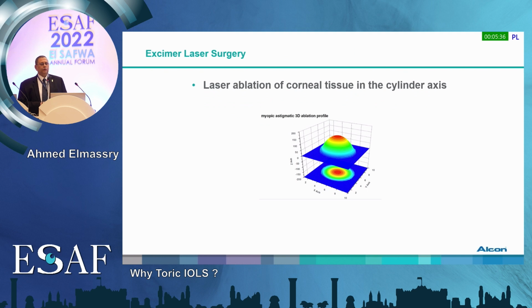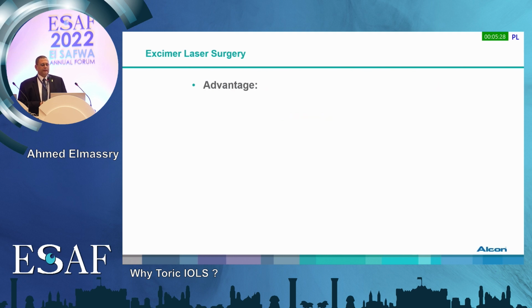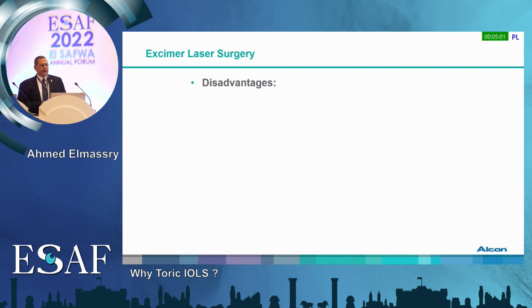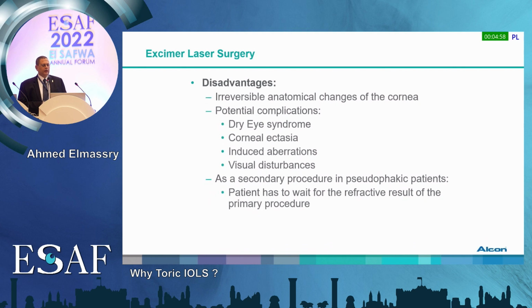Laser surgery, as we said before, is now the modern surgery for correction of astigmatism. As you all know, whether for remnants of cylinder after the cataract surgery or in highly demanding patients who want to get rid of what's remaining of the cylinder, it has the advantage of precision, and it has been evidence-based, as Dr. Ala said, with reproducibility of the laser surgery in correction of astigmatism, whether it's topo-guided or wavefront guided, taking care of the crystalline lens, and whether there is any role of the lens in this case, because we are just correcting the corneal astigmatism.